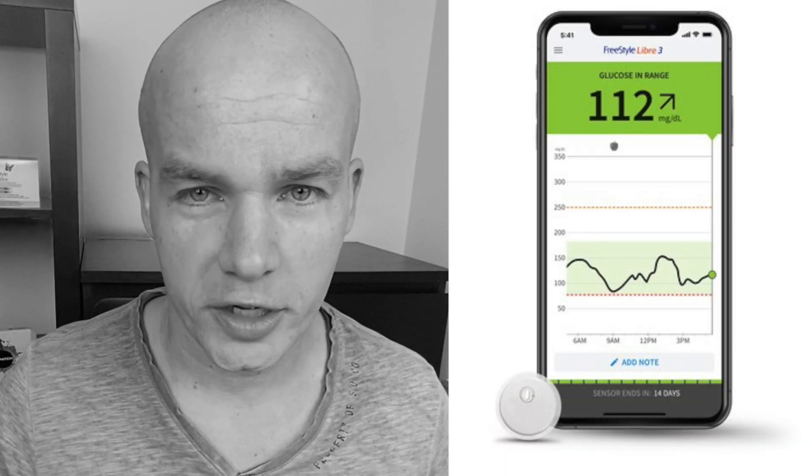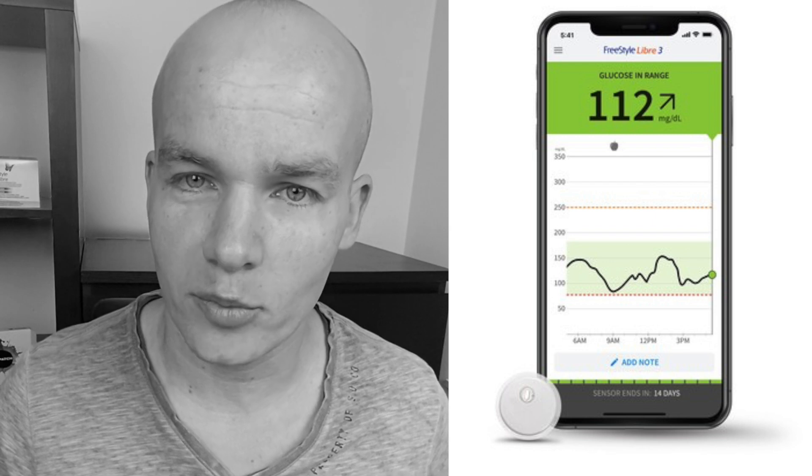Improvement number 3: the new Freestyle Libre 3 app. The design is exactly the same as the Libre Link app — they just added the number 3 in it. I expect the app will have similar functions to the Libre Link app, but I also hope there will be some new cool features connected with the fact that Freestyle Libre is now actually a CGM. The Freestyle Libre 3 app should be available on both Android and iOS, and the phones used with previous generations of Freestyle Libre should work with Libre 3 as well.